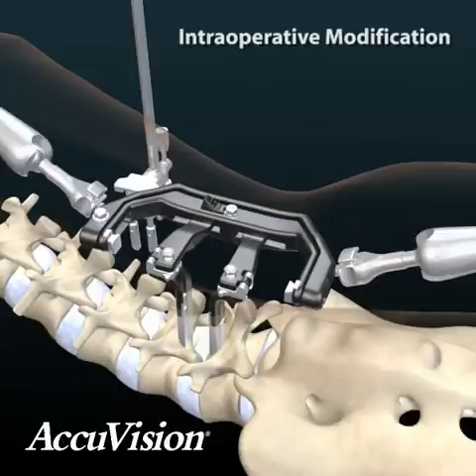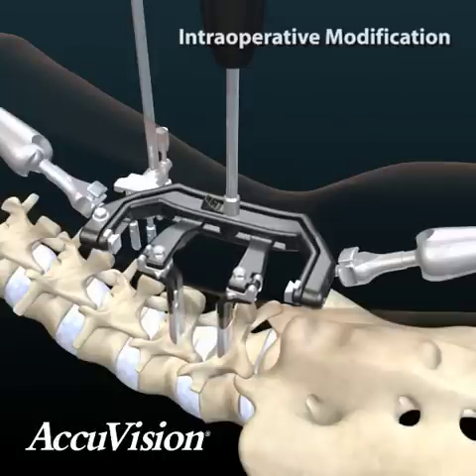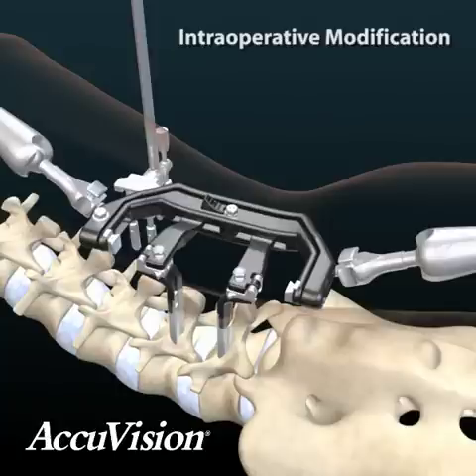Initial cephalad caudal distraction is achieved by utilizing the hex wrench placed on the center hex nut and turning it in a clockwise rotation until the proper amount of exposure is provided. It may be necessary to extend the skin incision and fascia release to ease pressure against the blades and allow for additional visualization into the surgical site.